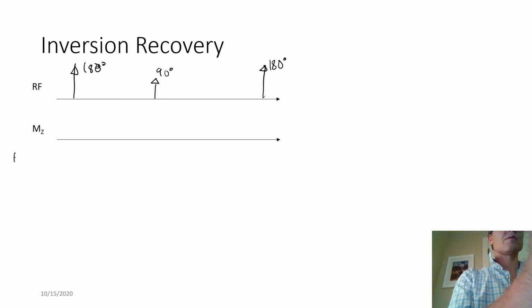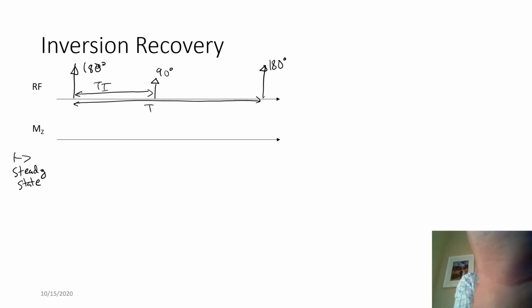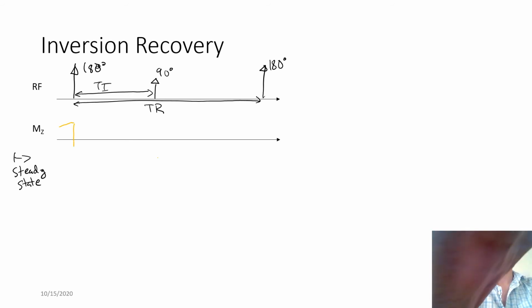And we're going to assume that we're in the steady state, which actually occurs after the first time we apply the sequence, after the first TR. Okay, and we've got to do some algebra here and some bookkeeping to figure out what's going on. So we have, sketching the last slide here.